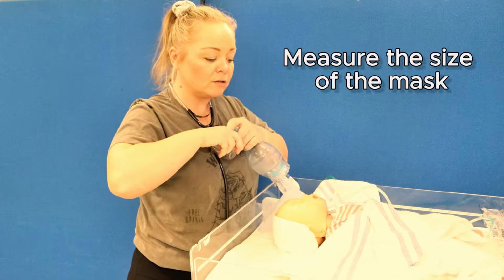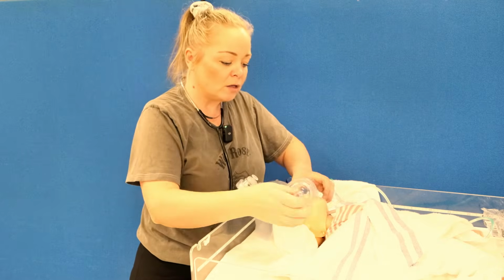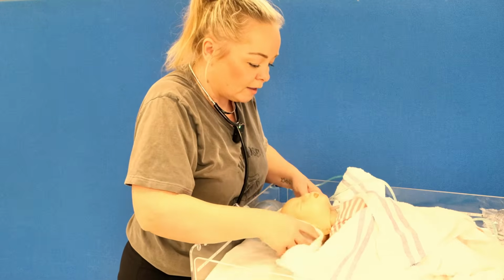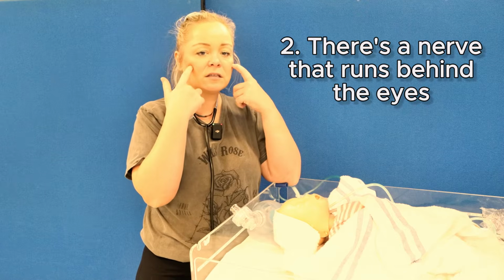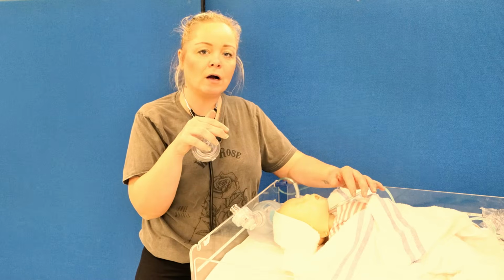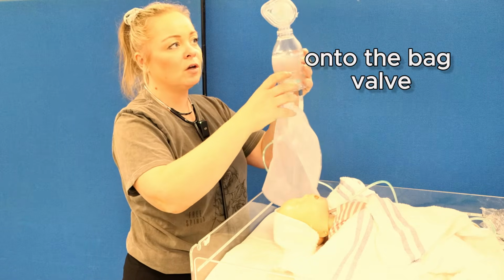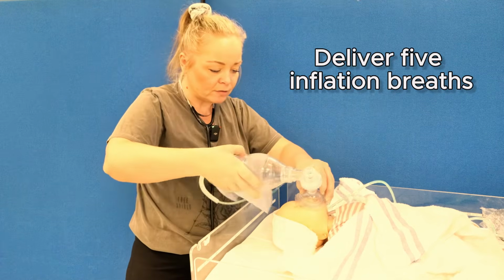We're going to measure the size of the mask because you may get a large baby, you may get a preterm baby, so all the masks in your trolley will be different sizes. You want to measure it from under the lip to over the nose. You don't want to go over the eyes. We don't want to occlude the eyes, one, because it might not be very comfortable, but two, there's a nerve that runs behind the eyes, a vagal nerve, that might stimulate a bradycardia. If the infant's already got a slow heart rate, we don't want to make that worse. So measure up the mask under the lip and over the nose. Attach the mask onto the bag valve, off of the face, and then we're going to deliver 5 inflation breaths.